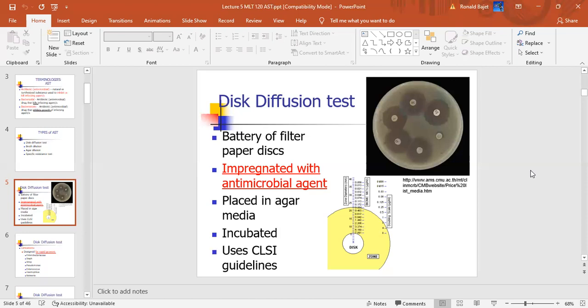Okay. So these antibiotics kind of simulate in vitro the medicine or whatever you get from the pharmacy. So this can be amikacin, it could be vancomycin, it could be nitrofurantoin. You're not going to put those pills on here.